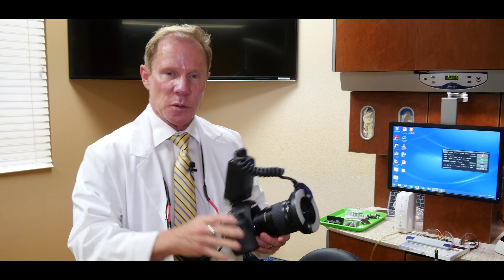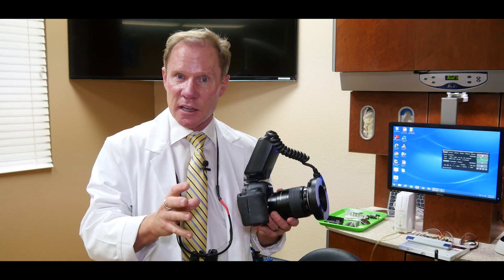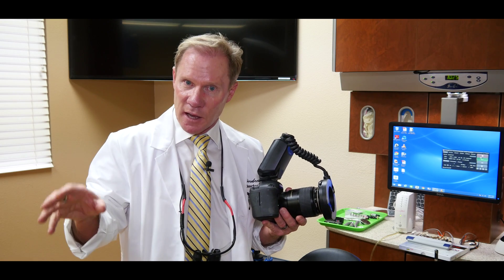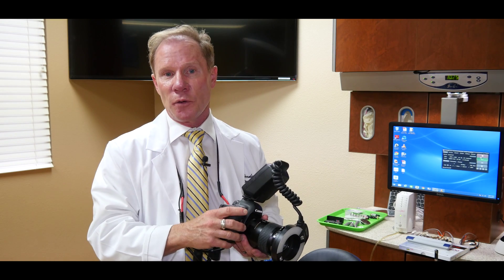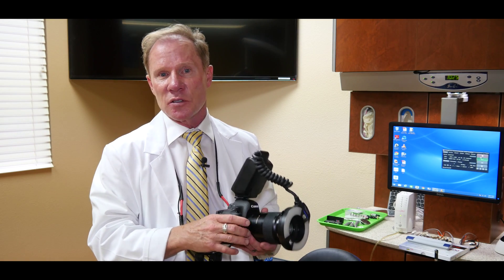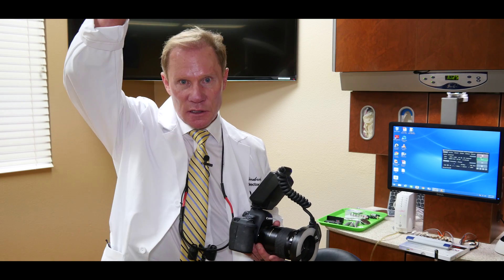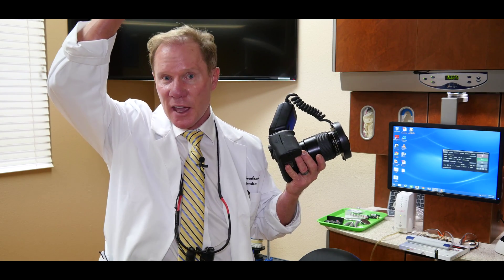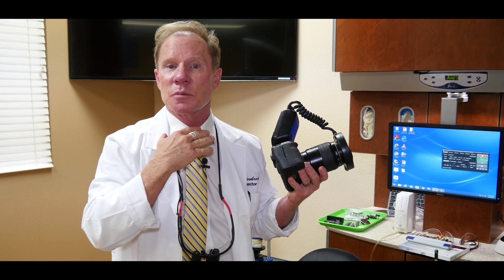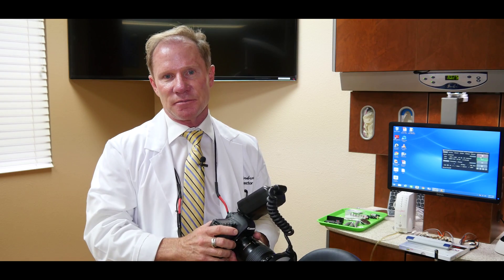That's important because we want the same image size for the before and the after. With our full face, typically I use about a one to ten, so I have a nice amount of space both above the head as well as below the chin and both sides of the ear.